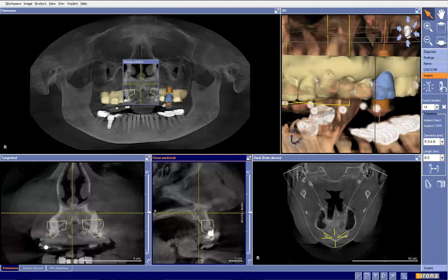We have been sent a case to evaluate site number 14. The message asks: could you review this plan? The submitter thinks the buccal margin may be out a little too buccal. More importantly, they need to do a sinus bump of 4 to 5 millimeters and want to use a 6 millimeter Legacy implant from Implant Direct. Also, how would you plan the surgical guide — to the end of the sinus floor for the osteotomy depth, or to the ideal implant placement and then gauge the depth? Thanks for all the valuable info at the 3D Drive.